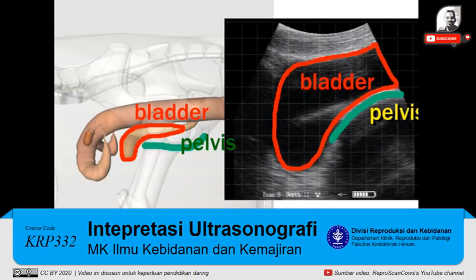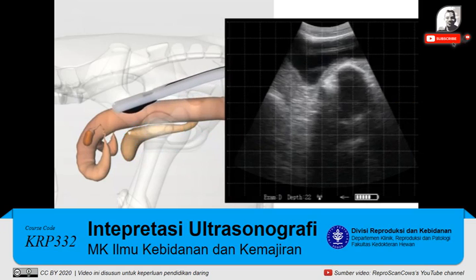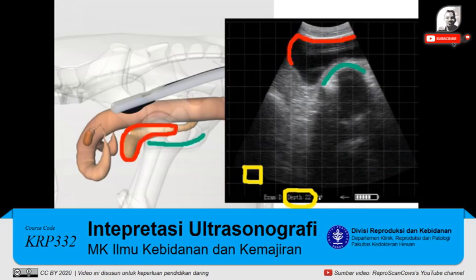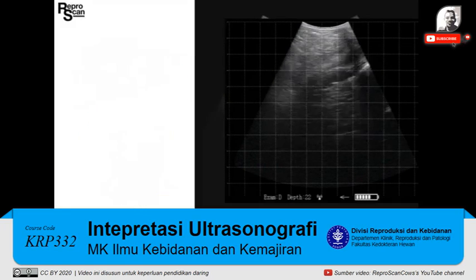Now let's insert the repro arm into this model. On the right we have an image at 22 cm depth with a 2 cm grid. There's the pelvis in green and the bladder highlighted in red. We're going to advance the repro arm further and highlight the uterus in yellow. There's our first image of a uterus on the right in yellow, with the bladder marked as well.